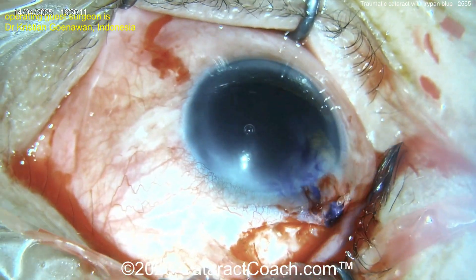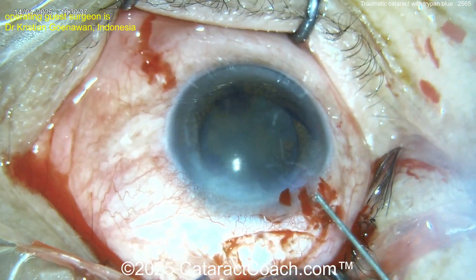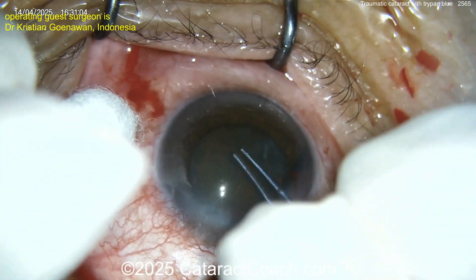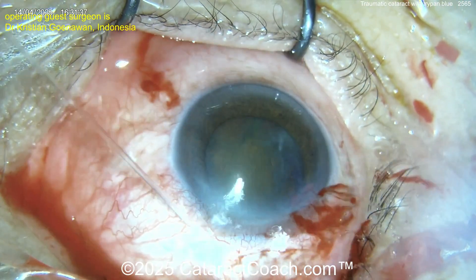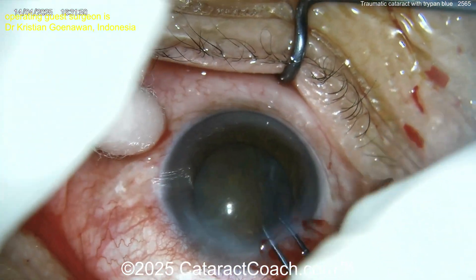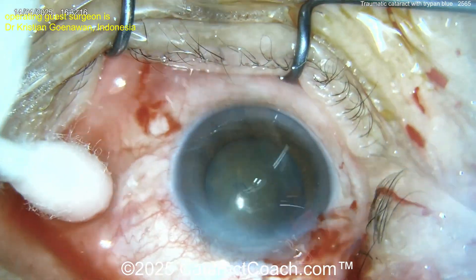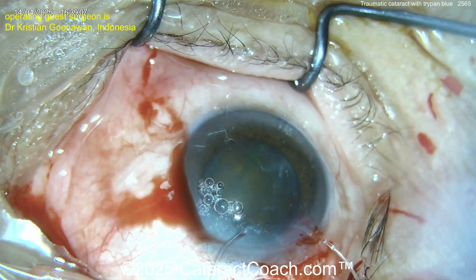Here comes another incision. Blue dye again — I just like to paint the blue dye on, not inject it all over the place. Now capsulorrhexis is being accomplished — that's pretty good actually. We have a very experienced surgeon here, and these traumatic cases are always tough because you never know exactly what you're going to get. With vitreous in the anterior chamber, I would have liked to place some triamcinolone.